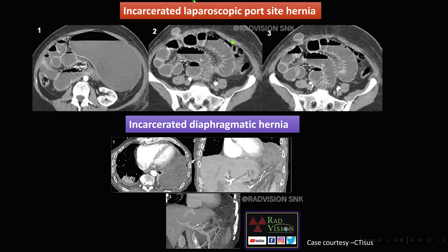Next, you can see this is an incarcerated laparoscopic port site hernia. Here also you can see herniation of bowel loops into the thorax — there is a defect in the diaphragm with abrupt cutoff of vessels at the level of the diaphragmatic defect. This was a case of incarcerated diaphragmatic hernia.